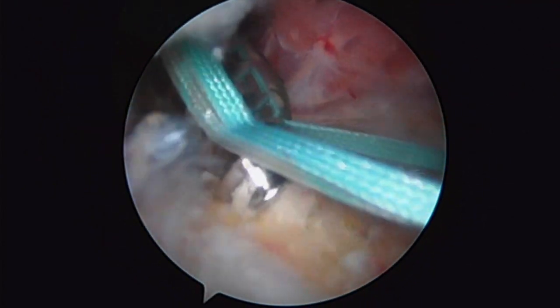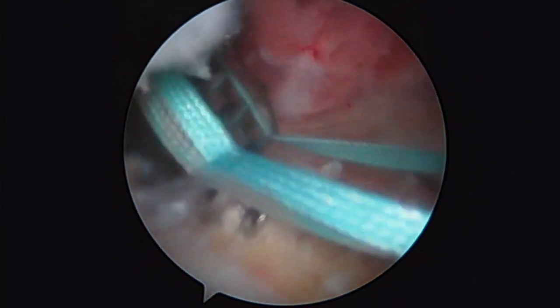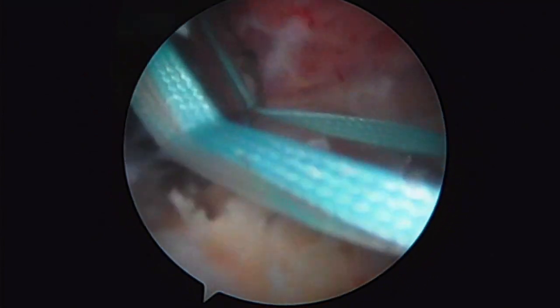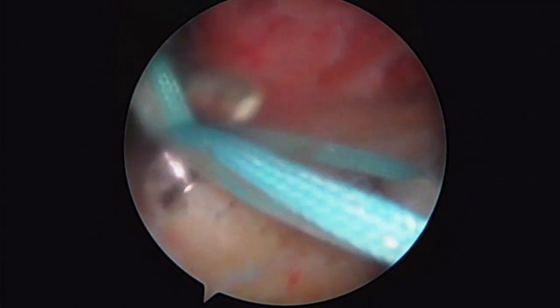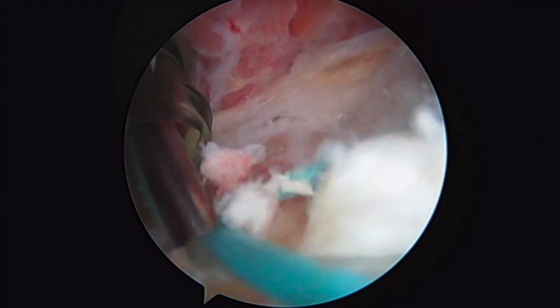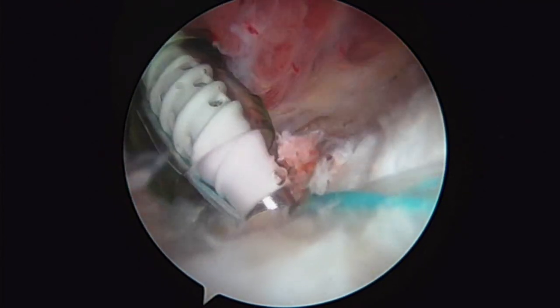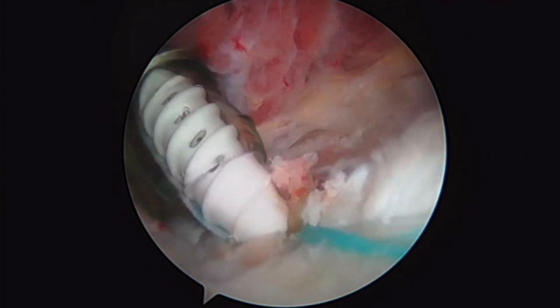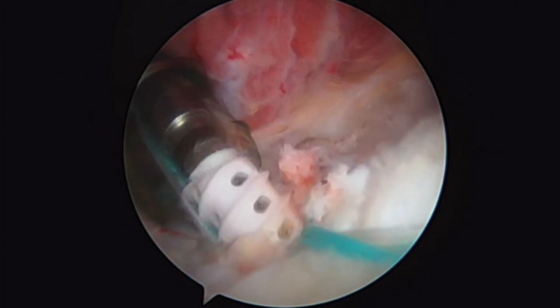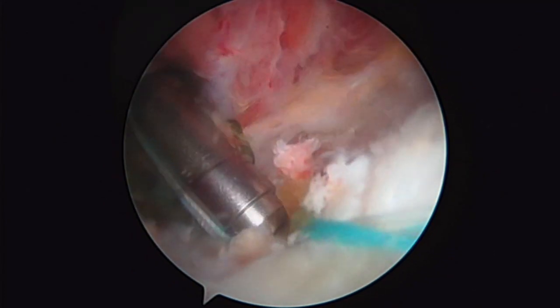This is going to be a double row repair. You've already seen our medial row anchors. Now what we do is bring out three posteriorly and three anteriorly with our suture. Here we are preparing for our lateral row anchors. This is a tap, which creates threads for our anchor. There you can see our anchor coming in — that's going to go down into its hole, and once we're happy with where it is, we slowly turn it down. The cool thing about these anchors is their hollow architecture — they don't have anything in the middle, which allows bone marrow to leak out into the repaired rotator cuff to help with healing.